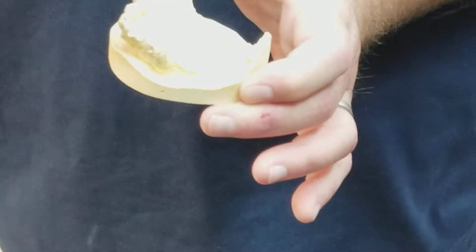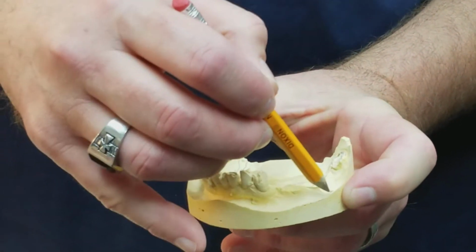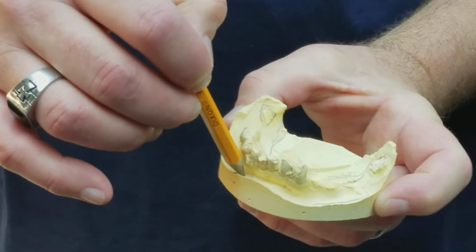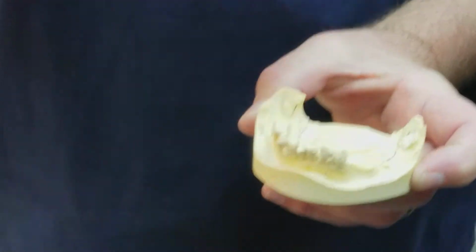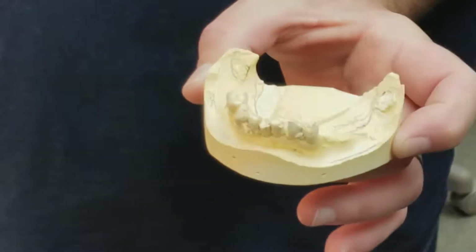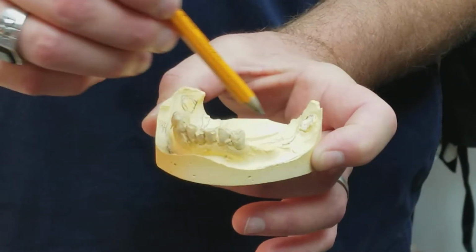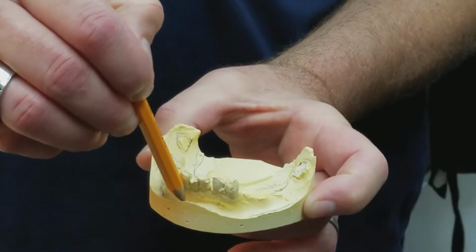have the rest seat and stability. Okay, and so out here you need your buccal and your labial sulcus. So when you're looking down and it starts to move out and go back up again, if you can see that it's prominent, then you don't trim past that, and that's what I'm looking for. So I can see it.